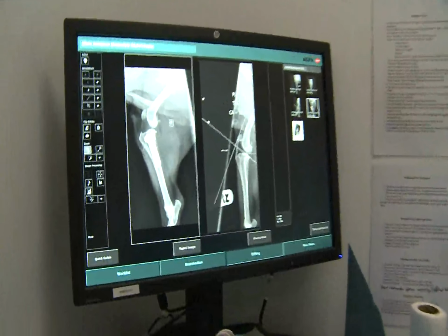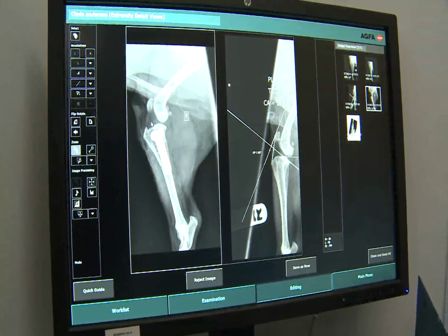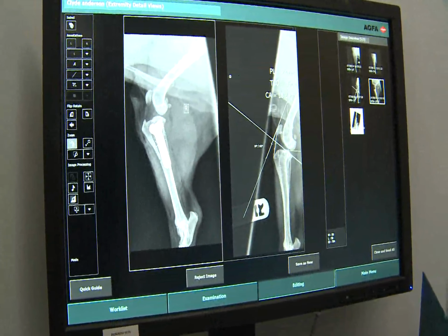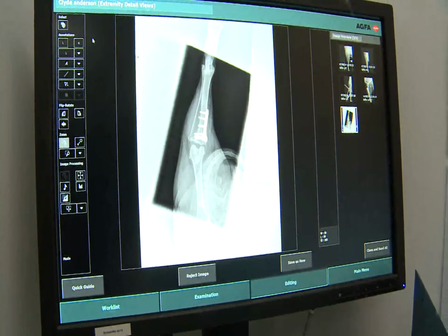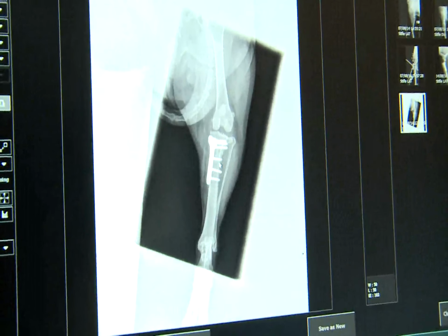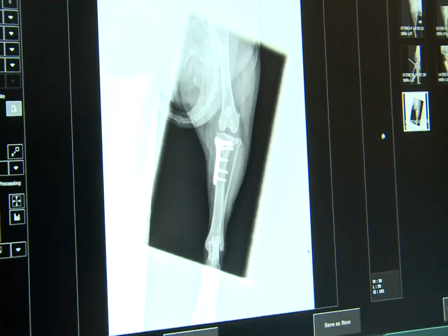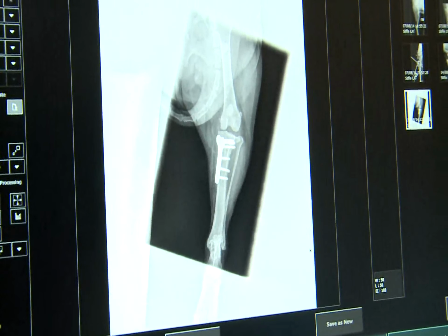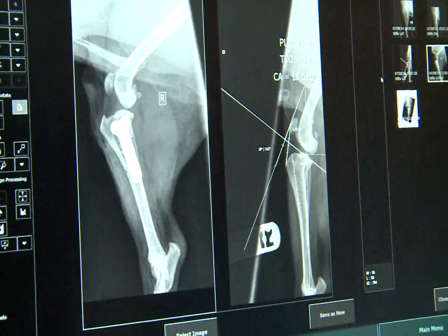So before, he had a very steep bearing angle on the surface of his shin bone. Now he's got a really shallow one because we've tilted the whole thing forward, made some cuts here and put a big plate on, and he's got 6 wee screws in there if we look at it from the other angle. 1, 2, 3, 4, 5, 6, holding those cuts in the bone in place while they knit back together again. And I'm happy with those x-rays, everything's in the right place. I haven't put any screws anywhere that I shouldn't have. So we're just going to go get him bandaged and make sure he wakes up comfortable.